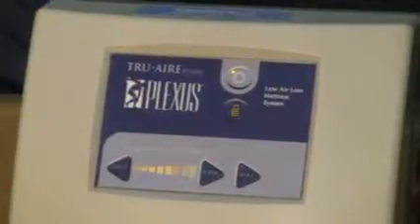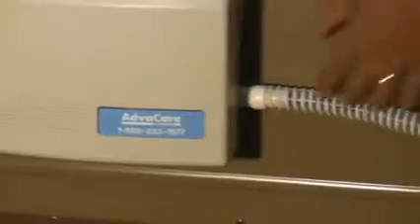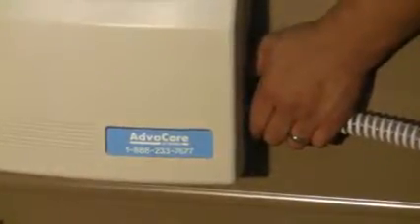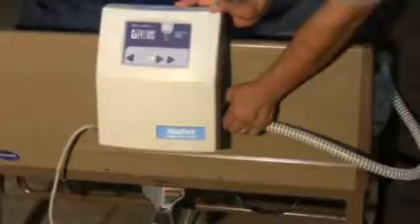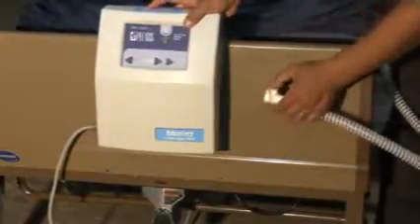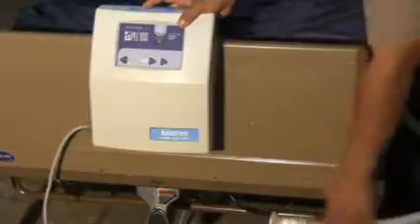For preventative maintenance purposes, you would like to ensure to check the filter location on the back side of the unit. You may do this by first powering off your air control unit, disconnecting your air hose from your unit by pressing the release button on the tube connection and pulling to separate it from your air unit.